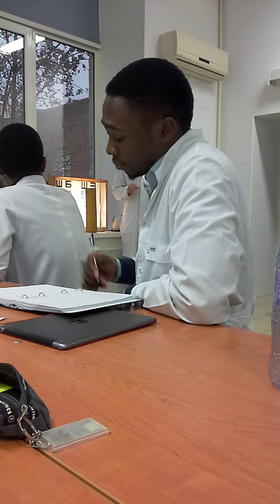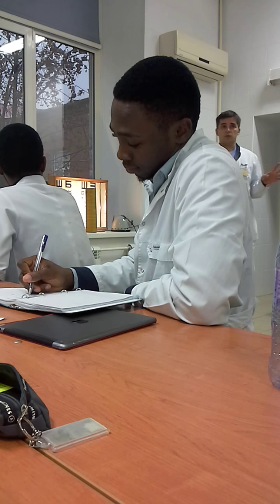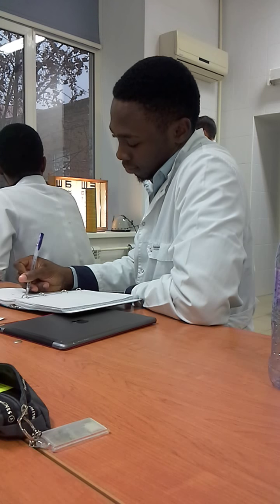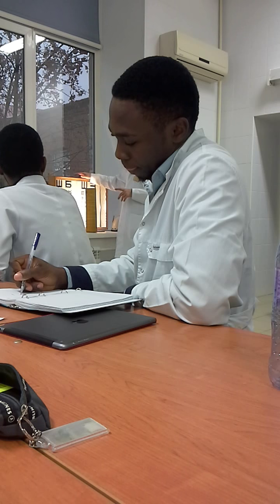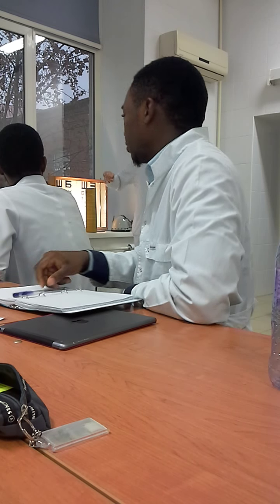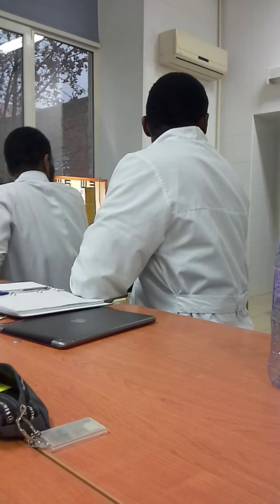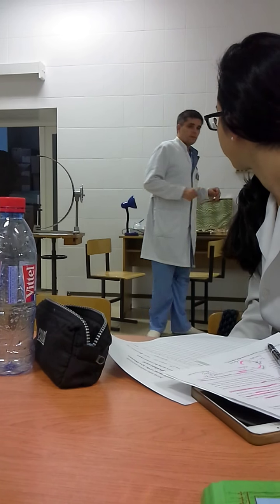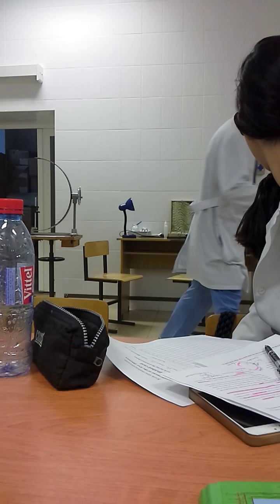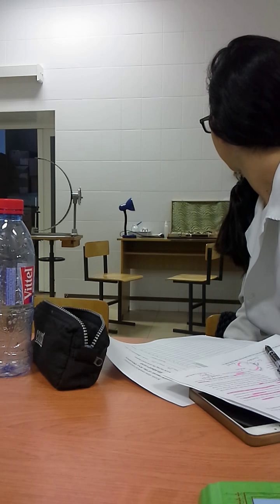We examine both eyes separately because visual acuity may be different in each eye. For all examinations, not only this one, we start with the right eye. We use a special cover — we give the patient the cover and cover the left eye, because we start with the right eye.